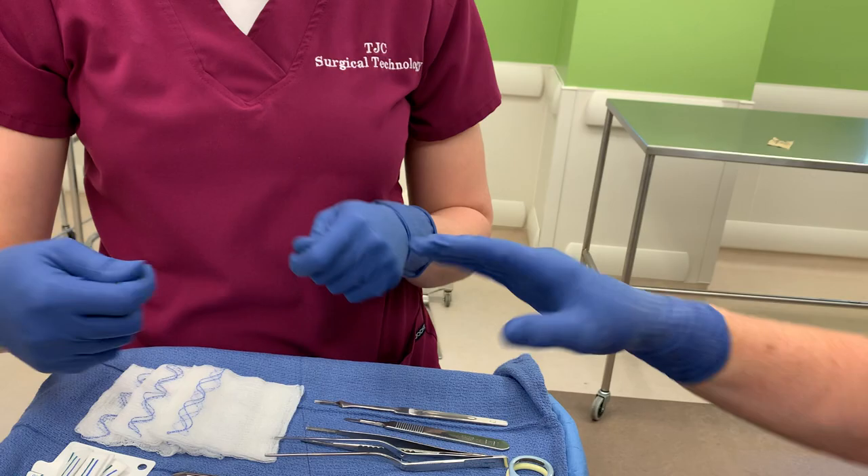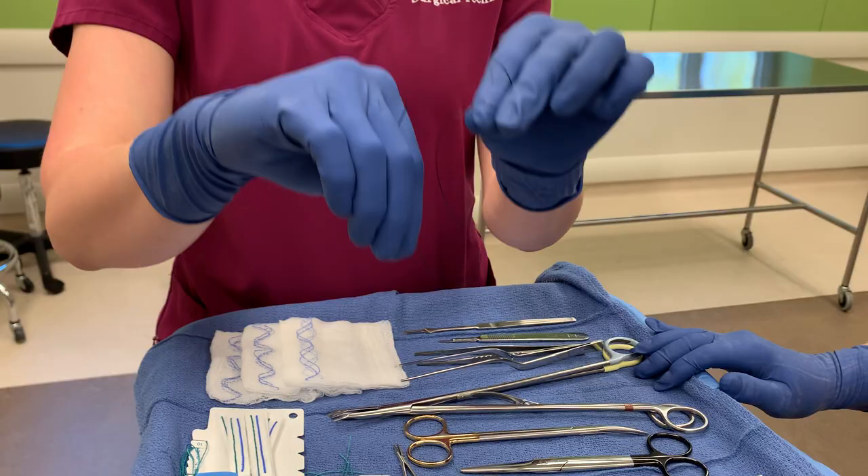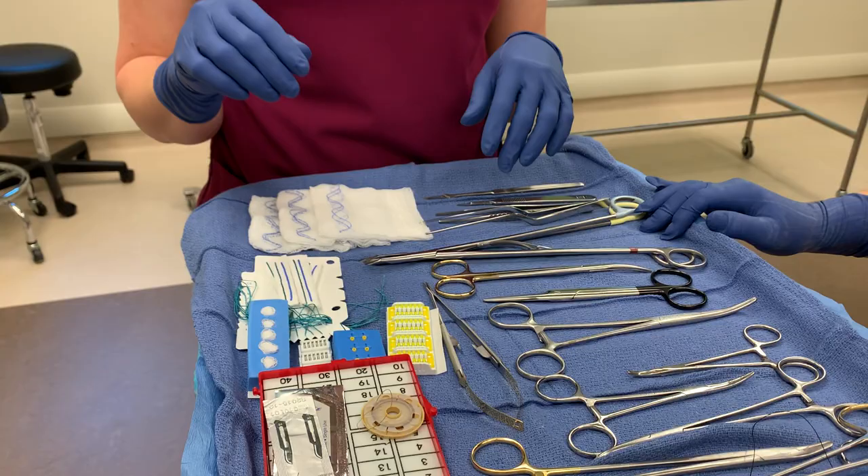That's what they would use for just a free tie. Free tie means it doesn't have anything attached to it — no instrument and no needle. It's just a tie by itself, hence the free tie.